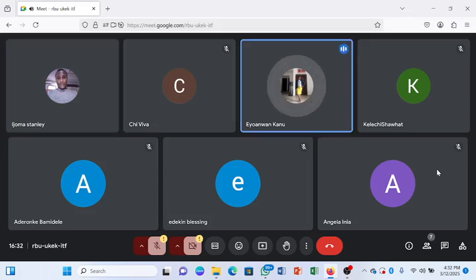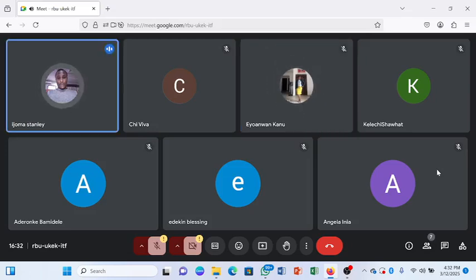I think 21 will be the 2 mil, while the 23 will be the 5 mil. That's why I say the smaller the number, the bigger the needle. The 5 mil has the 21 gauge needle, while the 2 mil has the 23 gauge needle. So the smaller the needle, the higher the number.